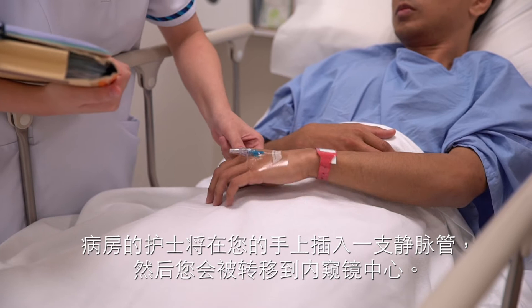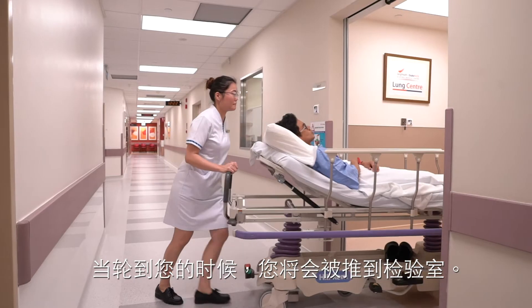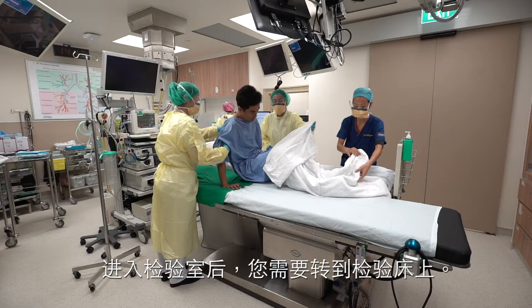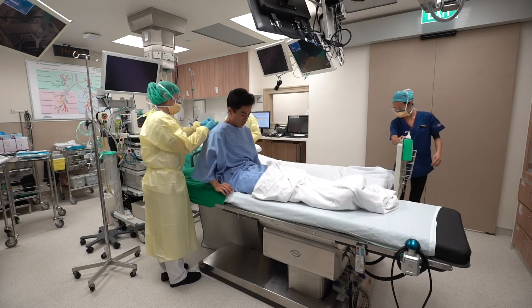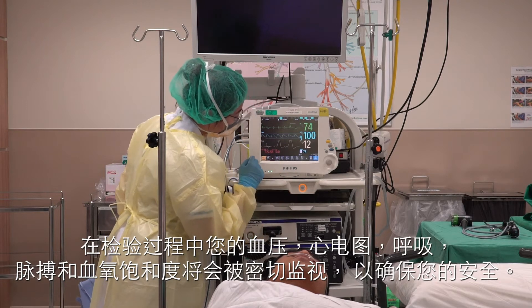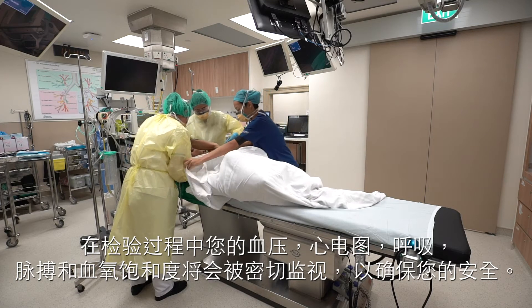You may have to wait on your trolley bed for the procedure room to be prepared. An intravenous cannula will have been inserted into your arm or hand in the ward. When it is your turn, you will be transferred to the procedure room. Monitoring equipment will be placed on you for constant monitoring of vital signs such as blood pressure, to ensure the procedure is as safe as possible.